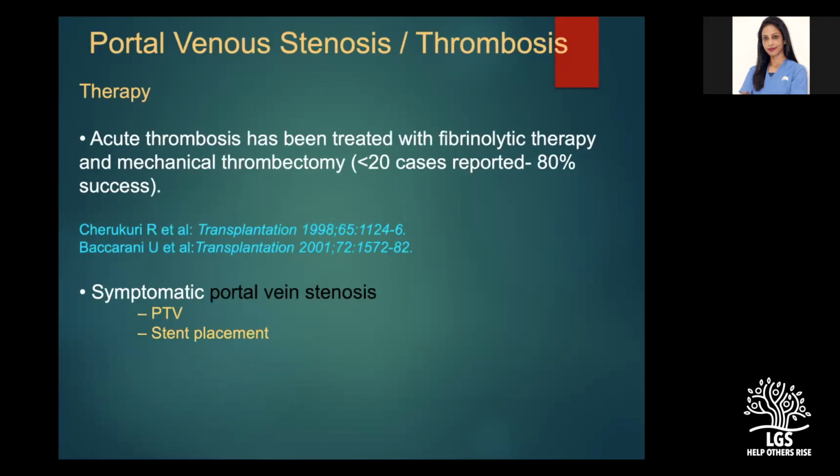Now, portal vein stenosis or thrombosis is something that we often don't get involved in, I don't know why, but out of India, we have done several cases of portal vein thrombolysis in the context of portal vein thrombosis. It's again a very, very simple technique to do. We have devices similar to stroke thrombectomy devices, newer catheters, newer gadgets, wherein we can just get inside the portal vein and suck the thrombus out. We don't have to put the patient on heparin. We don't have to put the patient on long-term anticoagulation, waiting for the portal vein to become patent.